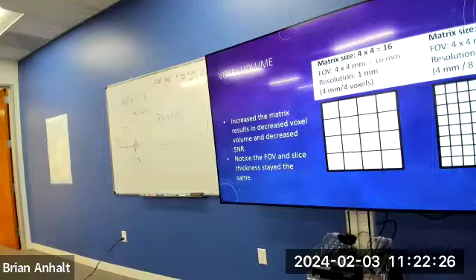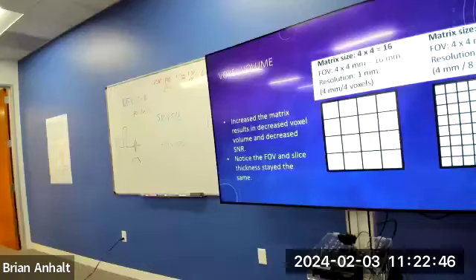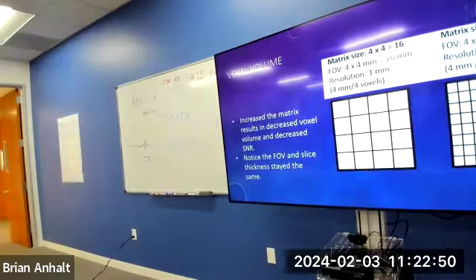Yeah, that was talked about too in the imaging, the rectangular voxel or pixel size. It's in the phase direction, typically, so we have the smaller, because of the shape of the body, right? Well, that would be phase field of view, that's different. We'll get into that too. Don't worry, we'll get there.